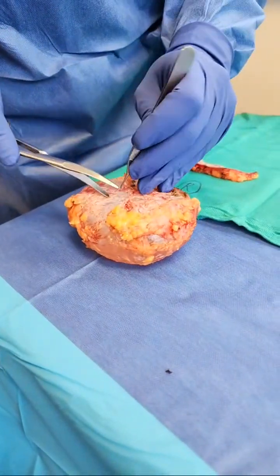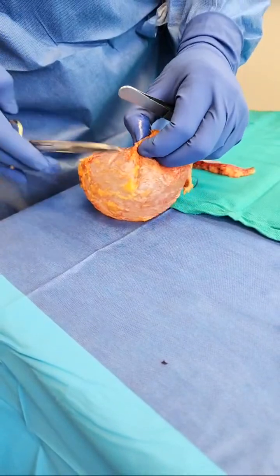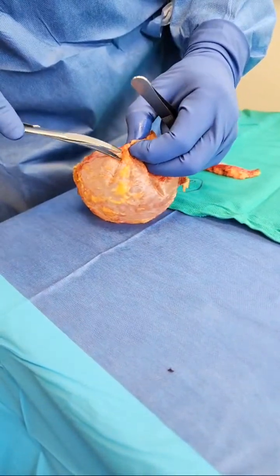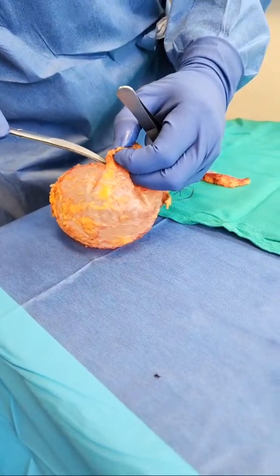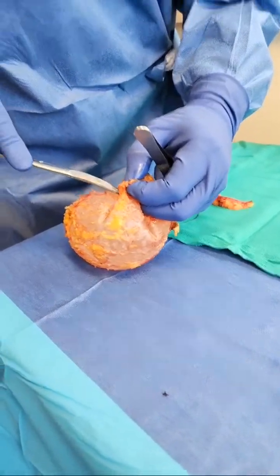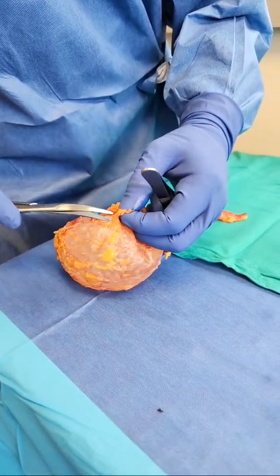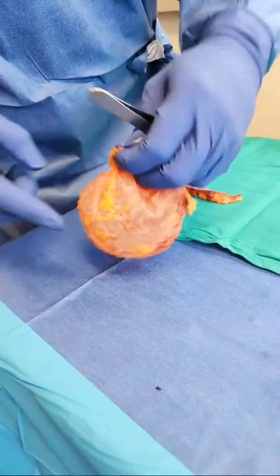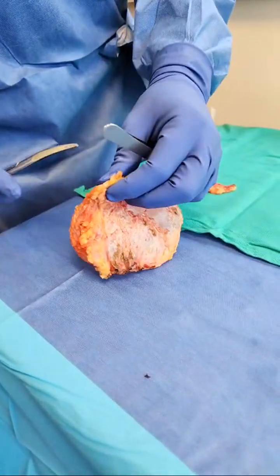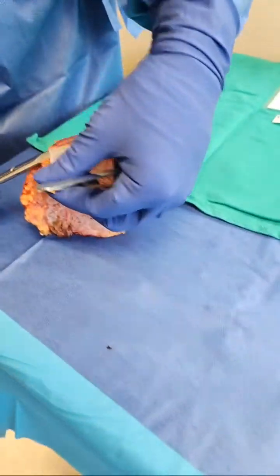So let me go in. I'm going to go in a little bit slow. Let me find another better access over here. So minimal blood loss, as you can see. I'm going to go in here. See how thin this is?